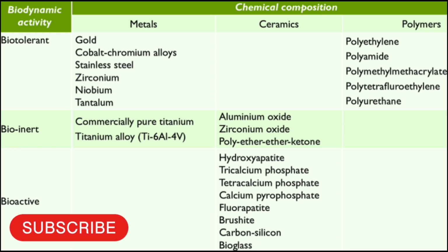In bioinert metals, we have commercially pure titanium and titanium alloy. And in bioinert ceramics, we have aluminum oxide, zirconium oxide and polyether ether ketone. In bioactive ceramics, we have hydroxyapatite, tricalcium phosphate, tetracalcium phosphate, calcium pyrophosphate, fluorapatite, brushite and carbon silicon.